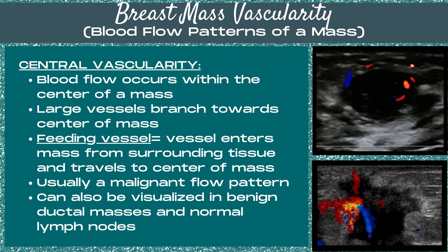The bottom image on this slide represents central vascularity — large feeding vessels moving towards the center of the mass with a chaotic pattern. With central vascularity, blood flow occurs within the center of the mass, with large vessels branching inward. These feeding vessels enter the mass from surrounding tissue and travel to the center. Central vascularity is usually a malignant flow pattern, but can also be visualized in benign ductal masses and normal lymph nodes.